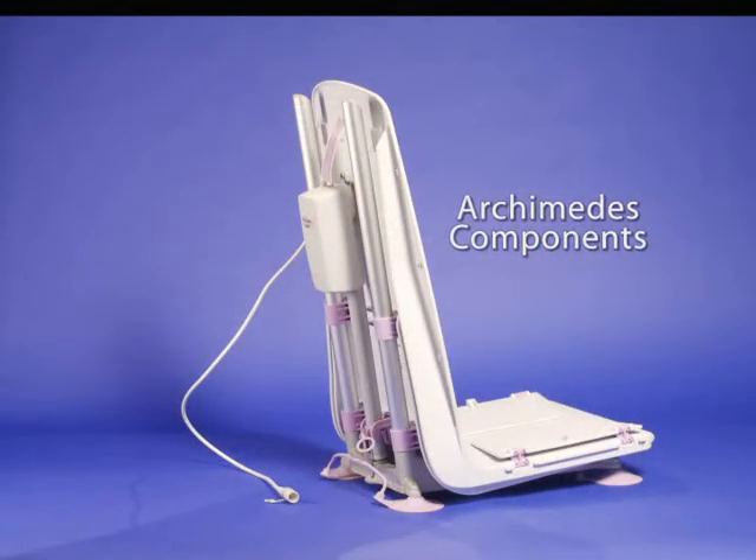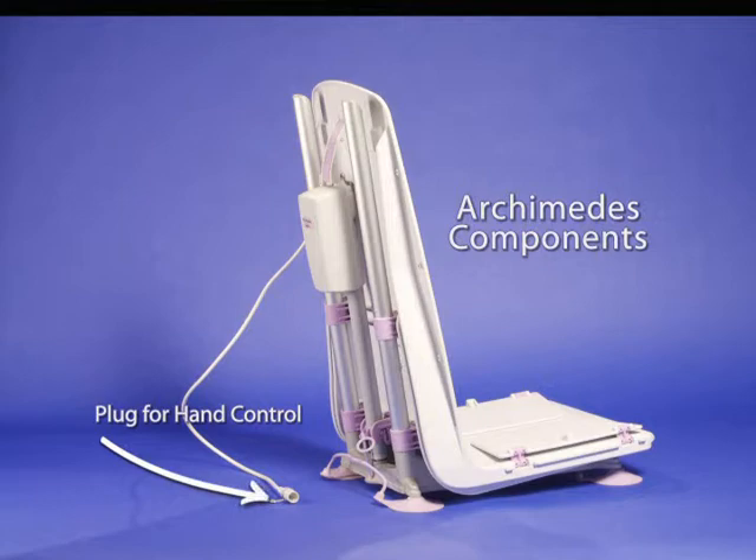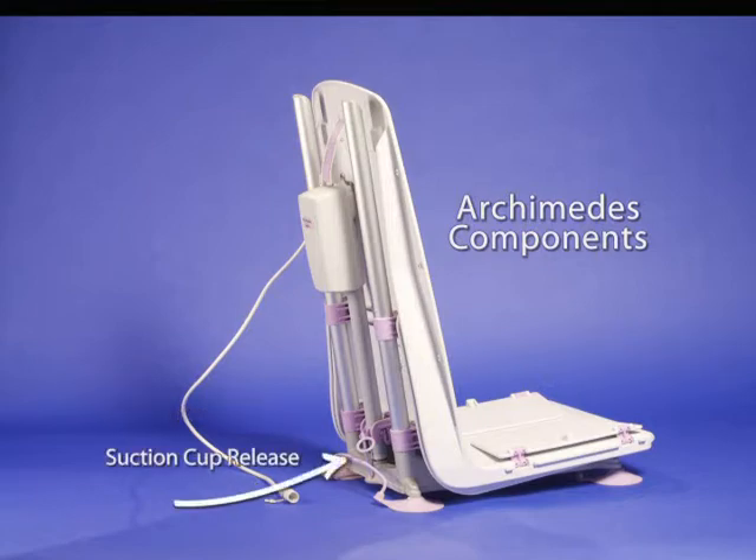These are the components on the back of the Archimedes: actuator release, actuator, transit tie, plug for hand control, and suction cup release.